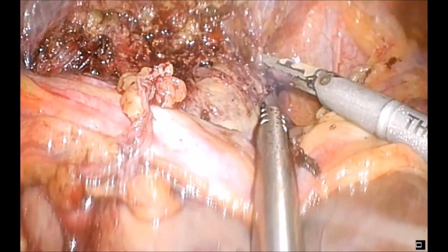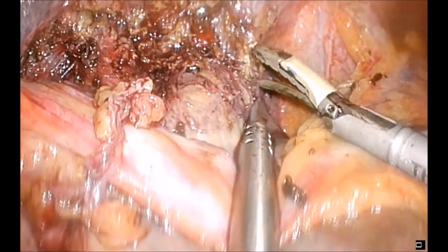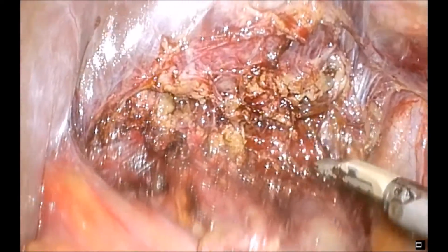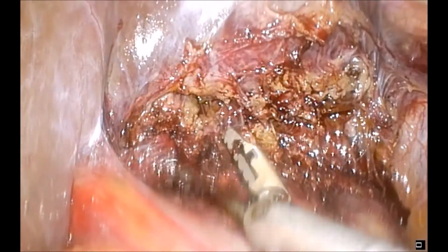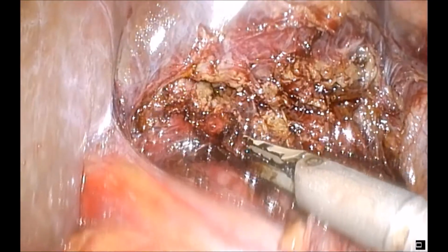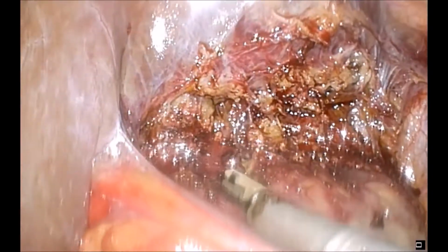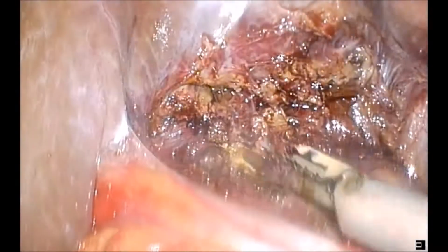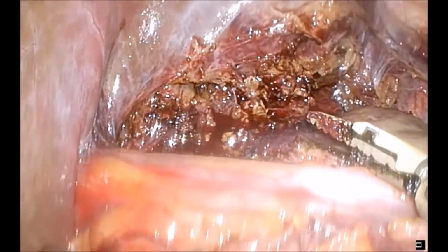We're now really dissecting into the bridge of liver tissue as the caudate crosses over to the main liver in front of and even to the right hand side of the inferior vena cava now. And this is to ensure that we get an adequate margin when we come formally through the parenchyma of the caudate here.